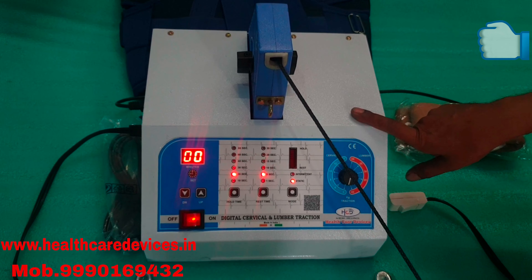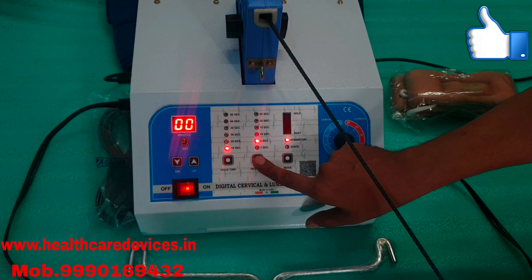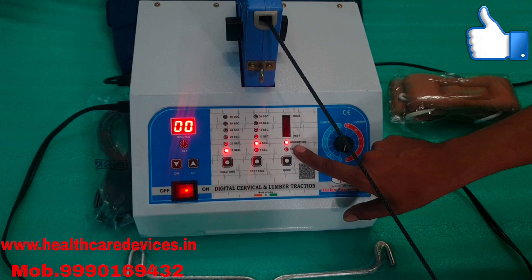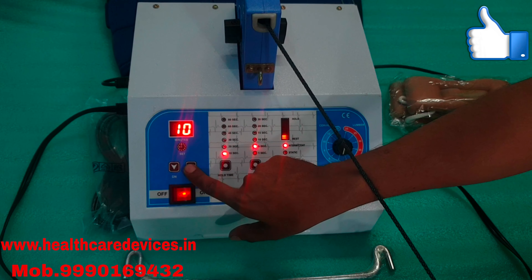So you have to set it in 10 seconds, then we will set it in 10 seconds, and now we will set it in 10 minutes.